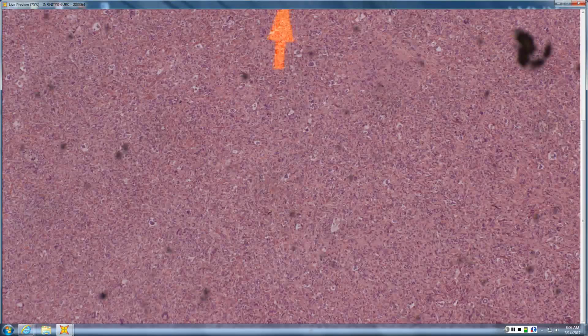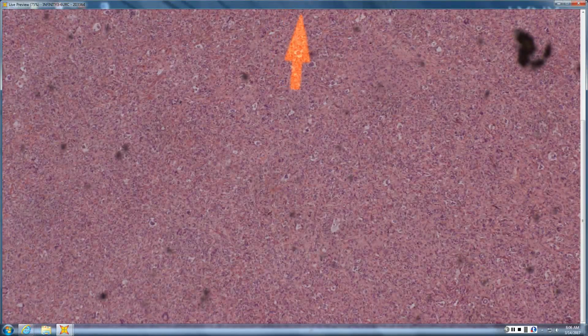You saw lots of giant cells. You said, well, that makes me think of JXG, but this is more of a fibrous tumor, so they also occur in DFs. And then you looked for your other clues of DF. You saw the collagen trapping. You saw those big monstrous cells, but you said, they don't scare me because I expect those in a DF, and I don't expect those in a translocation sarcoma. So you nailed the diagnosis. Well done!